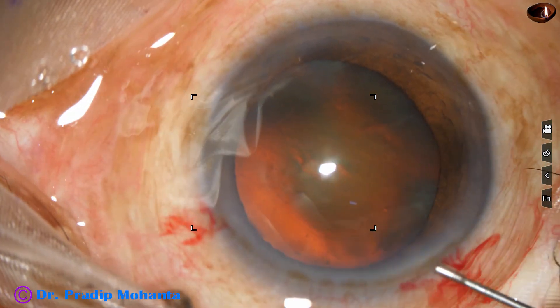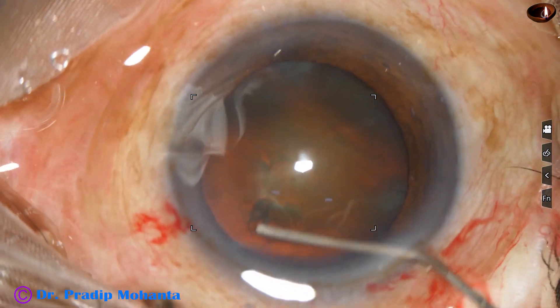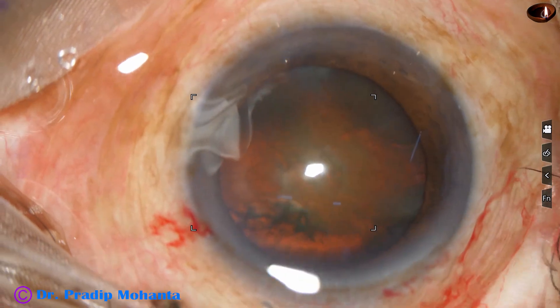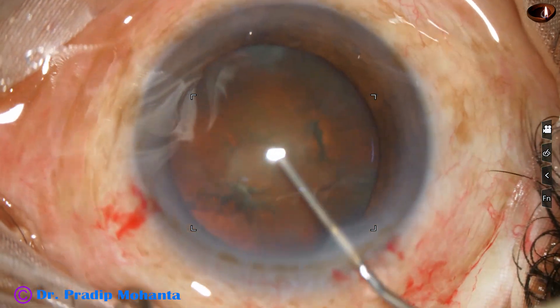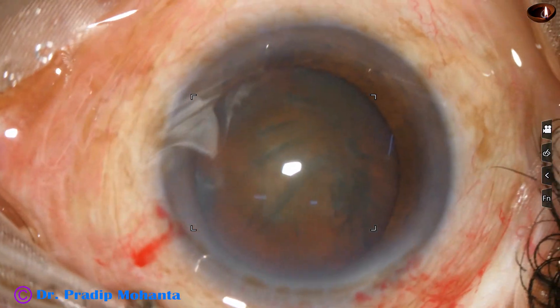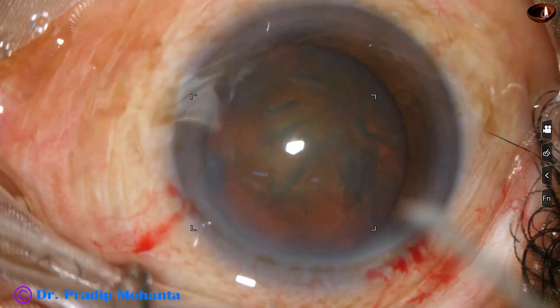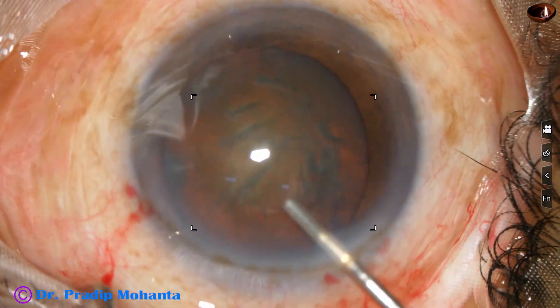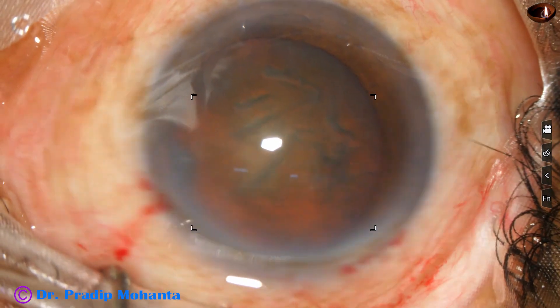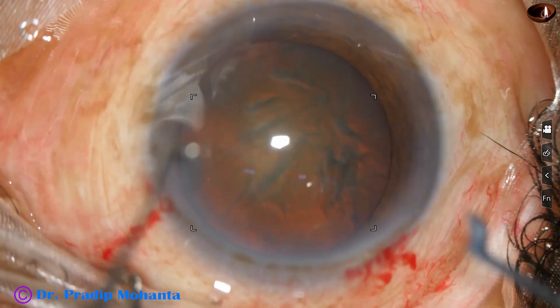Now hydrodissection is done. In hard cataracts, I inject small amounts of fluid at multiple points and tap on the nucleus, and the nucleus becomes mobile. The anterior chamber is again filled up with visco.